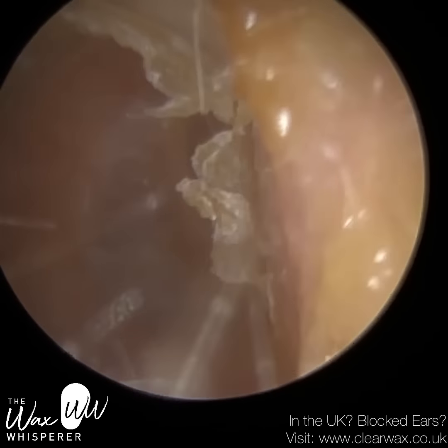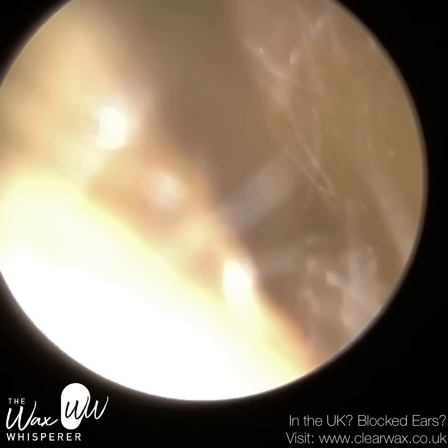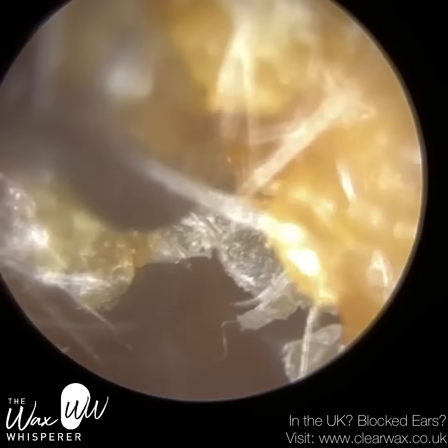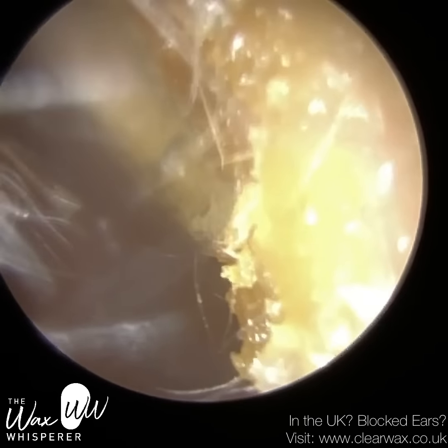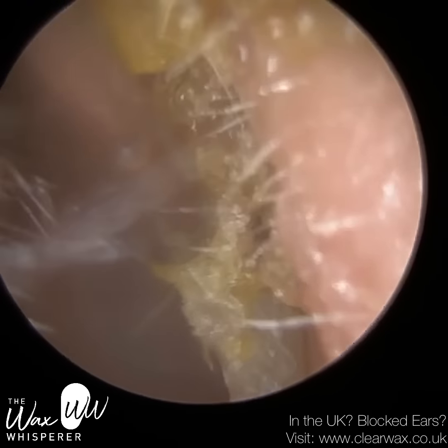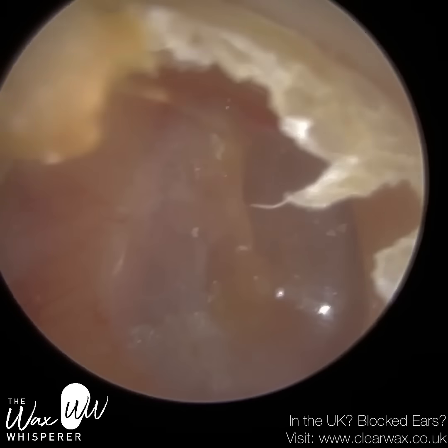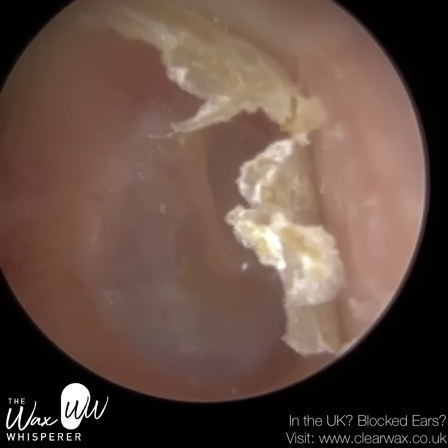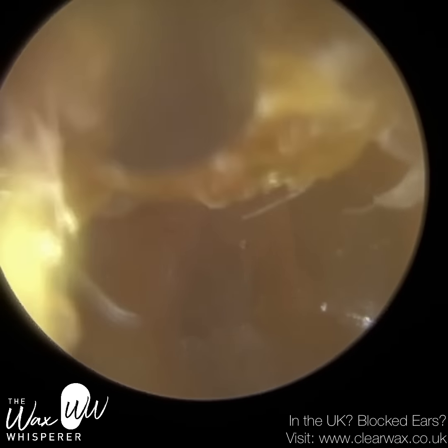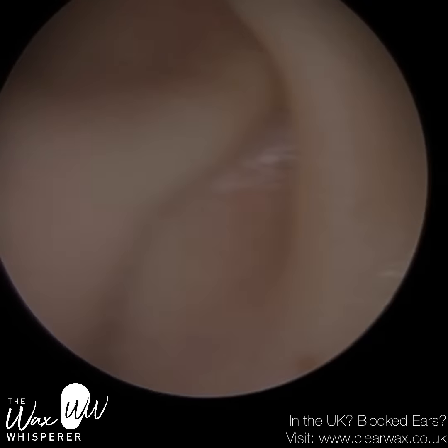So clarinetting is when you suction dead skin, the skin at the tip of the sucker, it violently flaps, and that violent flapping of dead skin emits a very loud, high frequency squeal, and it's not only loud for the patient, but it's also loud for myself performing the procedure. So if I'm finding it loud and my ears are not in the patient's ear, should I say, I am in the ear with the instruments, it gives you an idea of how loud it can be for the patient. So we've got to be really careful, and using a fine end really, really helps.